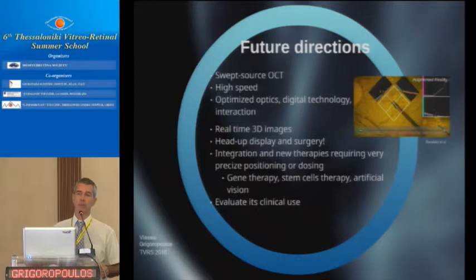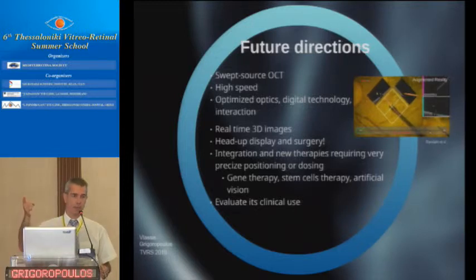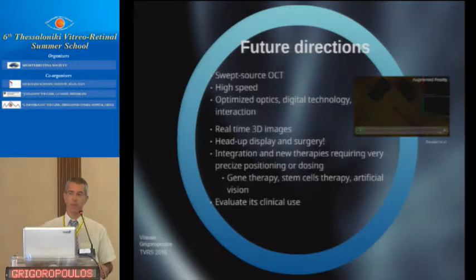So imagine, for example, the near future that we do a surgery like Eckhart did. We do it all through the computer screen. We can see the surgery from the computer screen. Imagine that you don't like what you see and you don't like the contrast. Then with software, you can change the contrast from color to black and white like we do in the Heidelberg OCT, for example. So some tissues show much better than other tissues.